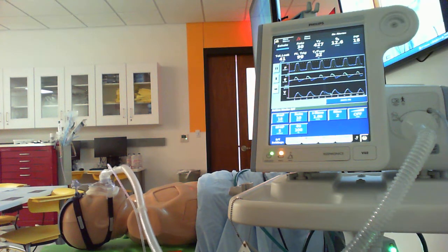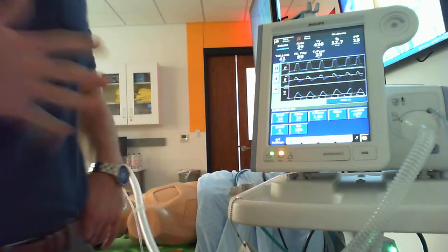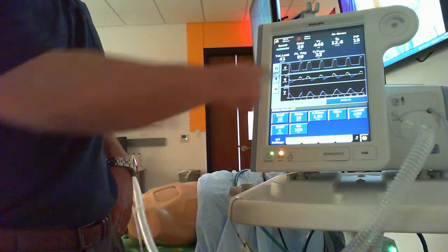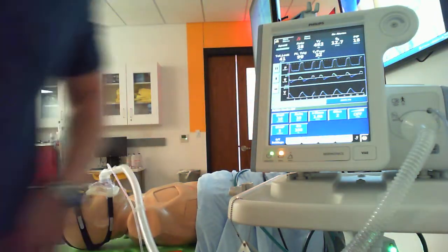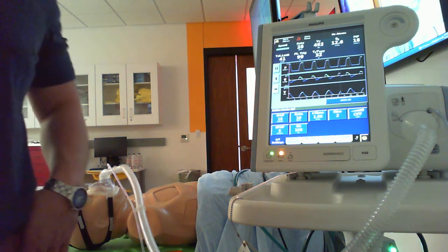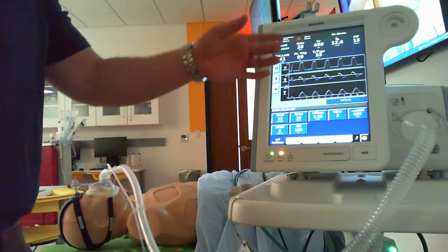So let's see. I'd be looking at my patient. The work of breathing is better, okay, or he looks improved from when I first initiated. Hopefully you can give me a thumbs up and tell me you're feeling better and can kind of confirm that. I'm reaching about 450 mils, something like that, which once again, 420 is a loose guideline. We're just trying to get somewhere close. It's not going to be exact. It's going to jump around. That's appropriate. It's not going to hurt anything, okay?